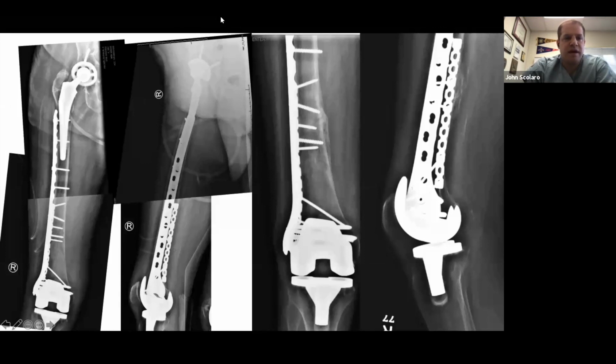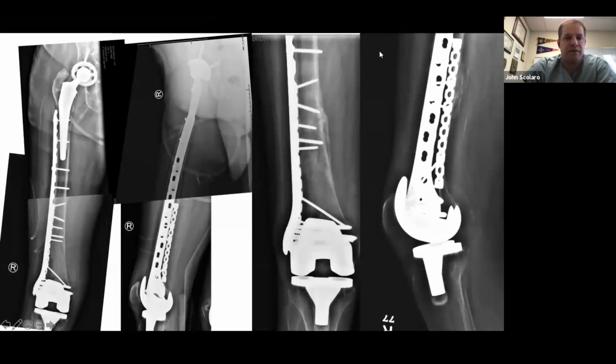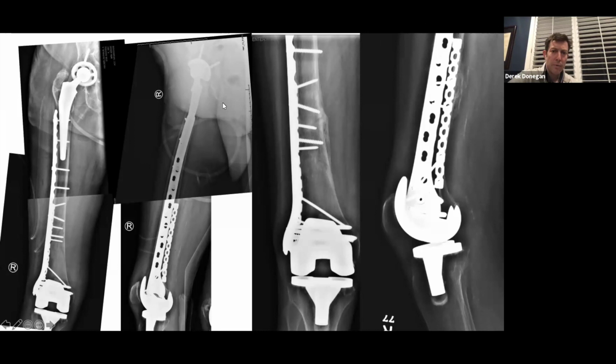Almost all of these implants now, especially ones that have options for multi-directional screws, or use of small fragment screws, you can get an anterior or posterior screw around most of the hip stems. And if I see cement, that's even better, because that's like great bone quality in my mind. So utilizing screws when possible to get around implants like it was done here. Yeah, I think that's great. I'm always disappointed with my lag screws in this type of scenario with poor bone quality as well.